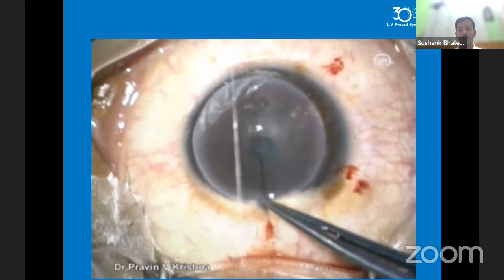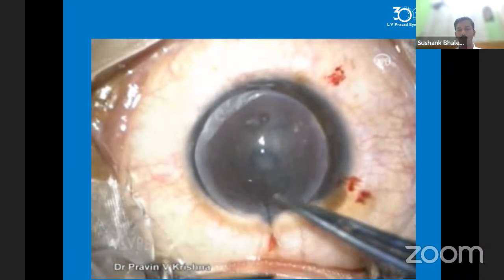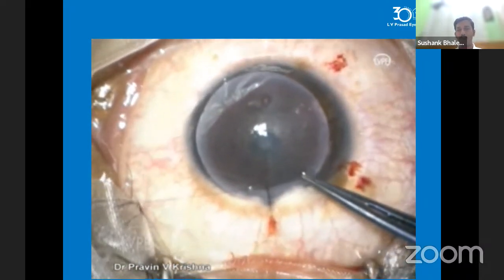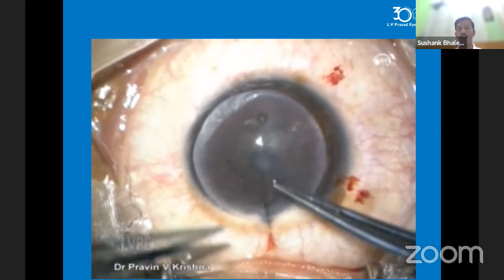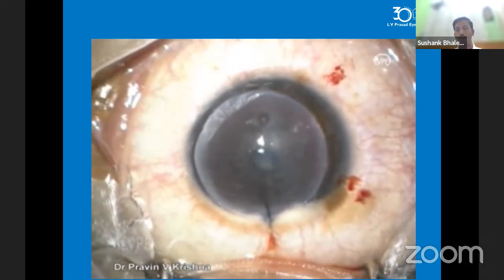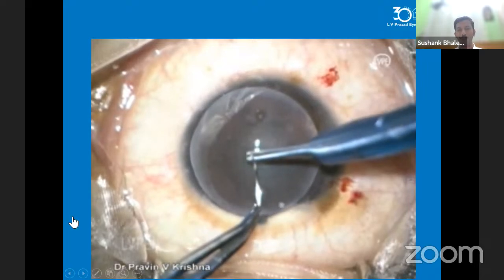Our general tendency is to tighten the suture, but we have to remember the goal of the surgery at every point of time. We just need to form the chamber very well, not a flat suturing. We need to form the contour of the cornea, and accordingly manage the tension and pressure. So this was the first cardinal suture, which was placed at the 12 o'clock position.